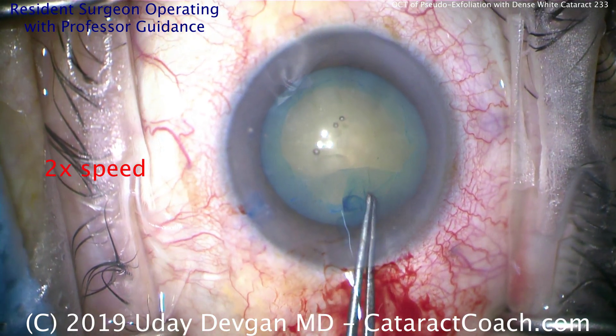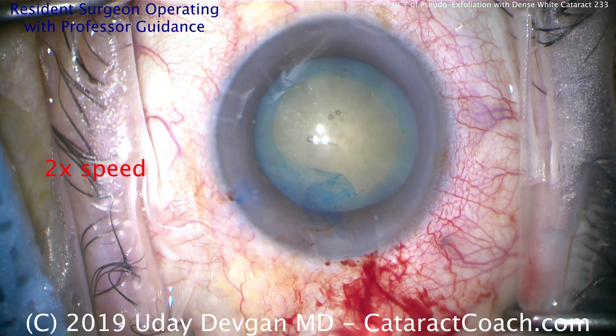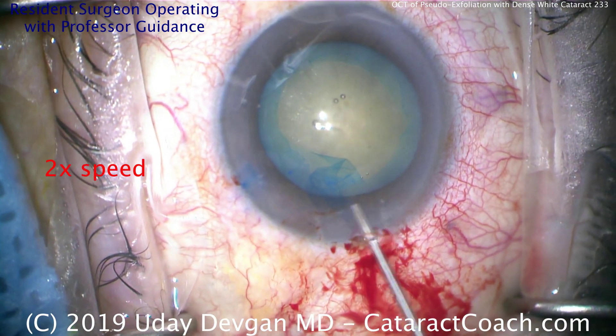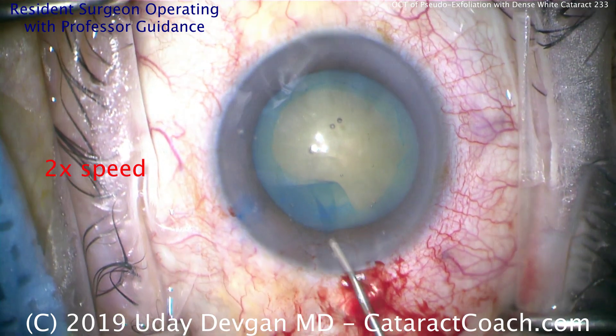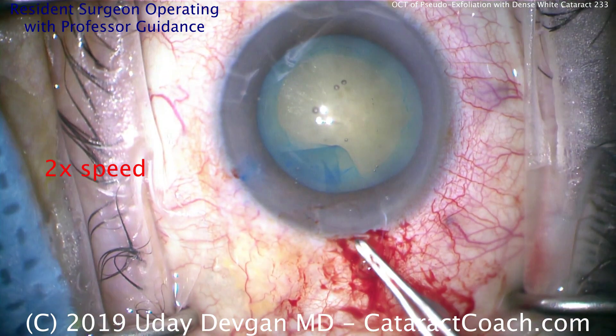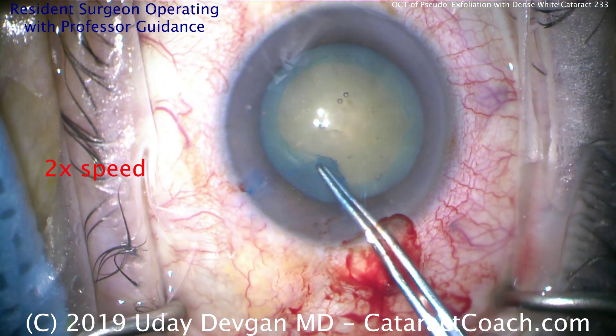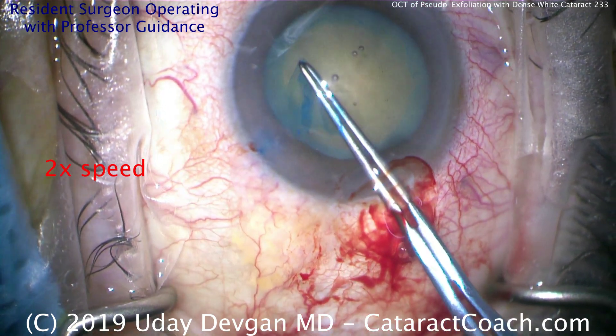Here he's continuing the capsulorhexis. Now in the sub-incisional area it starts to go out, losing a little control. This is a good time to put in more viscoelastic — so more viscoelastic going inside, deep in the eye, to position the capsule flap a little bit better. Now you can go in with the forceps, grab it, and finish. So again, we want a sufficiently large capsulorhexis.